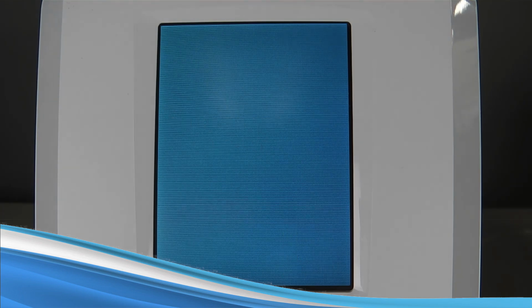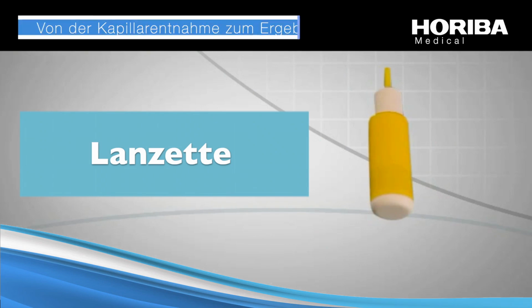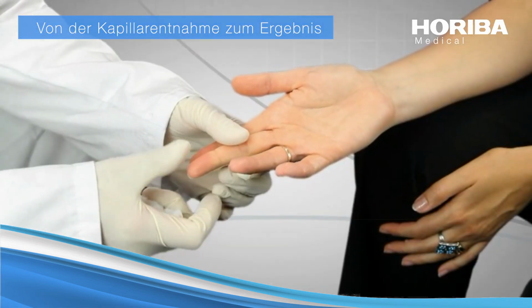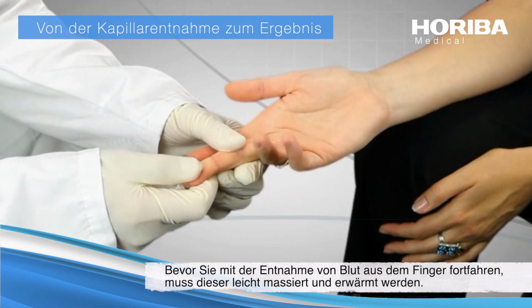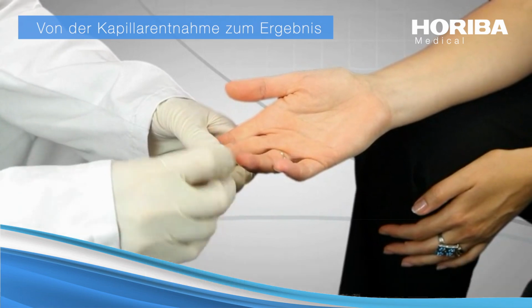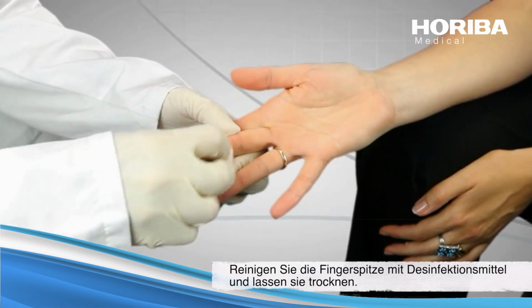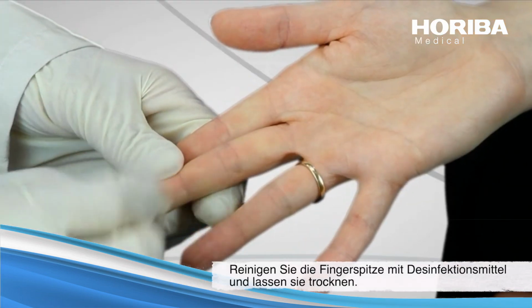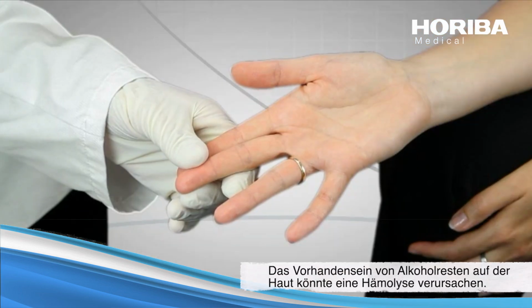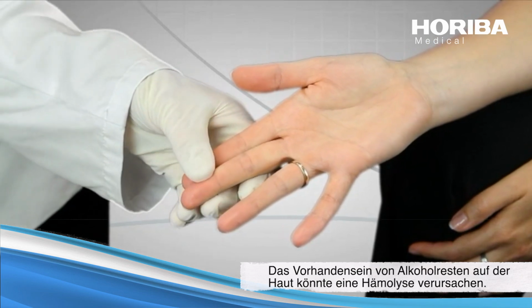The required material for capillary sampling is the following: lancet, sample tube. Before proceeding with the withdrawal of blood from a finger, it must be massaged and heated. Clean the tip of the finger with disinfectant and let dry. The presence of alcohol residues on the skin could cause rapid hemolysis.